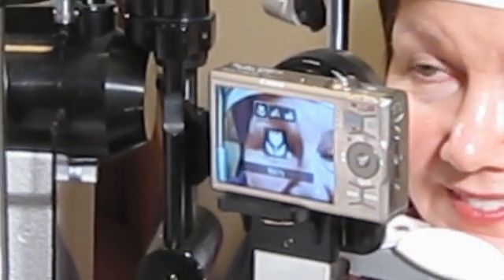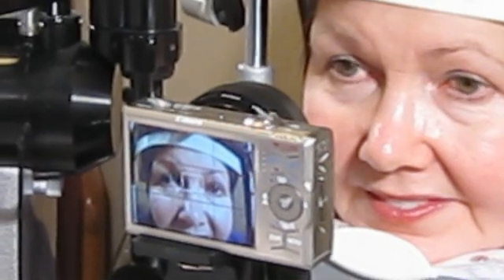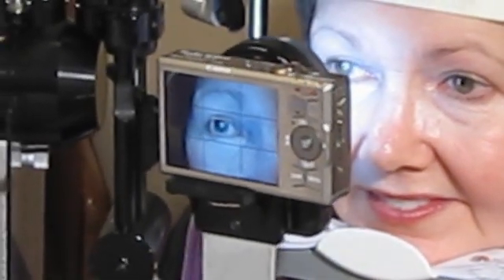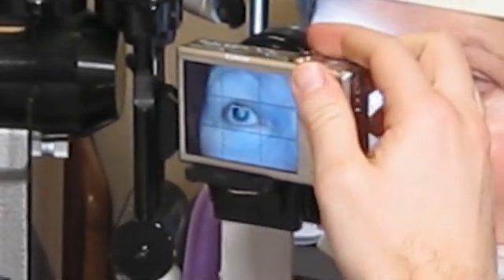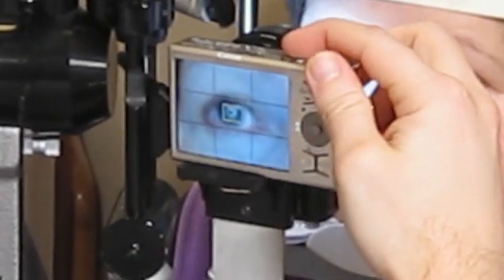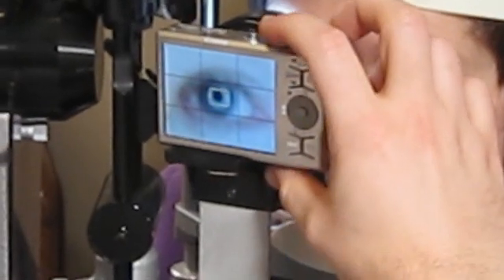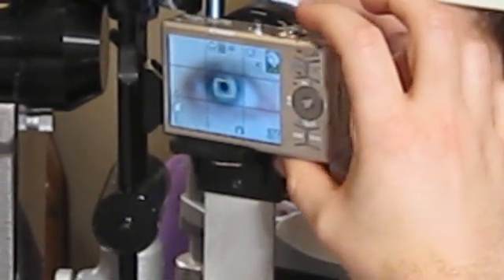The camera is positioned for the desired view, from the full face to minute anterior segment detail. Most external subjects, such as lid lesions, are taken using the battery-powered cold LED ring light mounted with the camera. That light will also generate a Purkinje image on the cornea and can be modified with a mask.